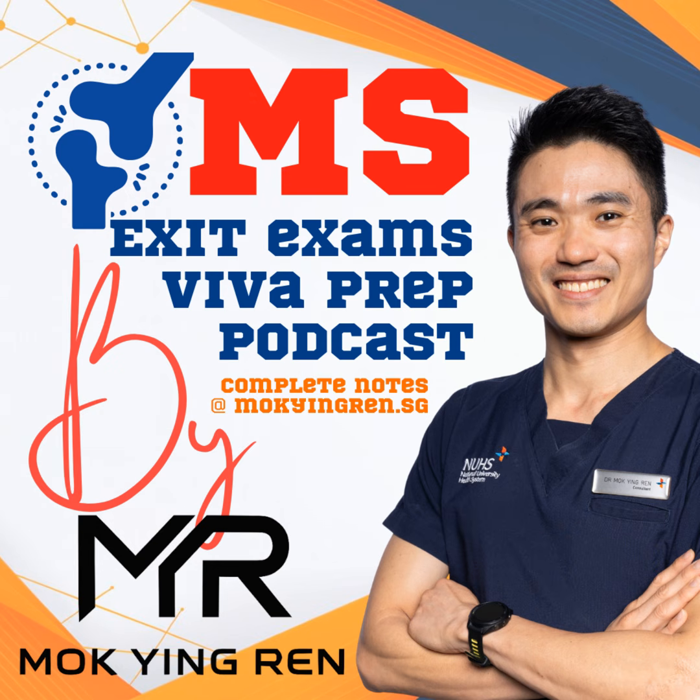That's the range. So the big decision point often boils down to CR versus PS. If PS often makes balancing easier, why would you ever choose CR? What are the key exam points for retaining the PCL? The main arguments for CR, the ones you need to know, are 1. Bone preservation. You avoid cutting the box for the PS post. 2. You theoretically preserve some proprioception because the PCL is still there providing feedback. Makes sense. And 3. You completely avoid any risks associated with the PS mechanism itself, like the post hitting the cam, this post-cam impingement, or more dramatically, the cam jumping over the post, which is cam jump.